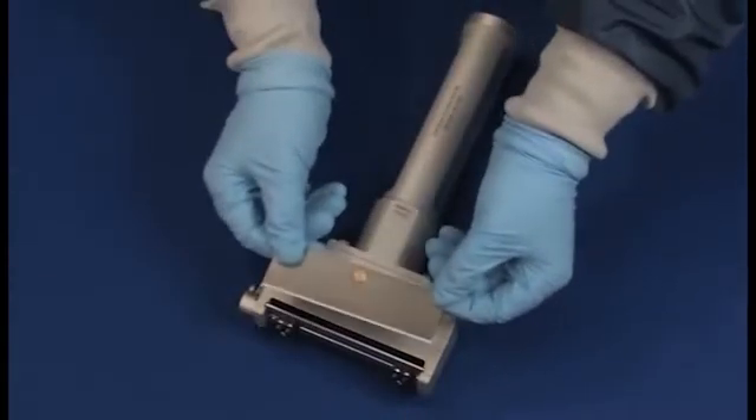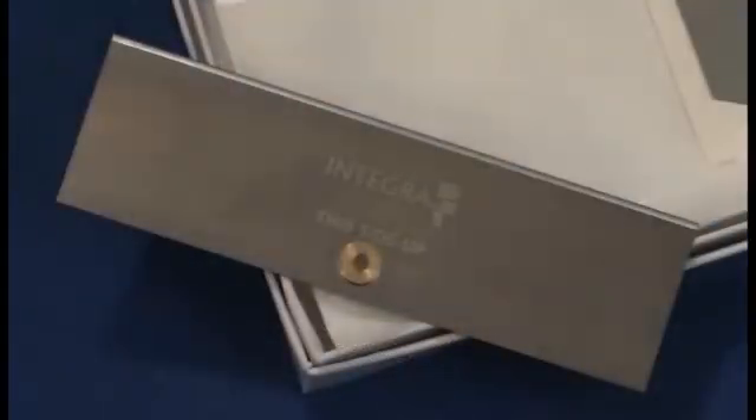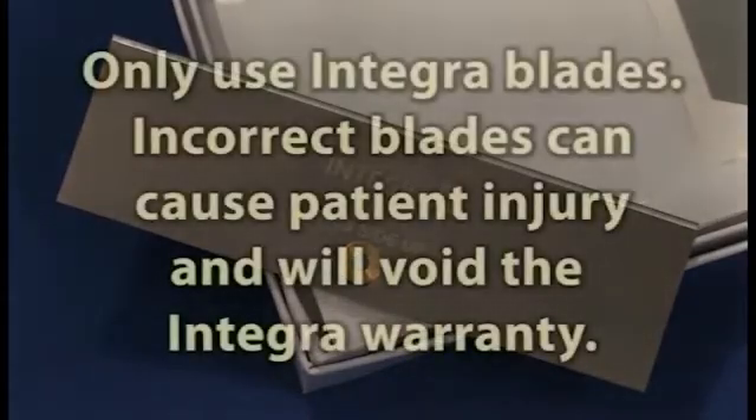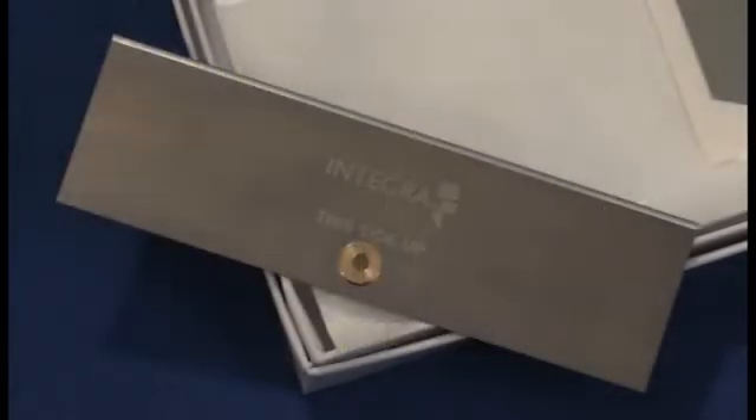We will now demonstrate how to properly install the blade on your Integra dermatome. Please note that Integra dermatomes should only use Integra blades, and Integra blades should only be used on Integra dermatomes. Failure to comply could result in serious patient injury and will void the Integra dermatome warranty.